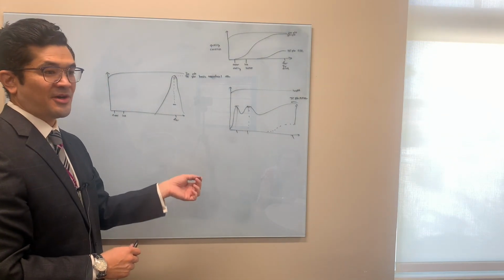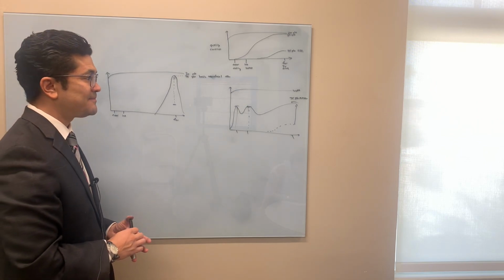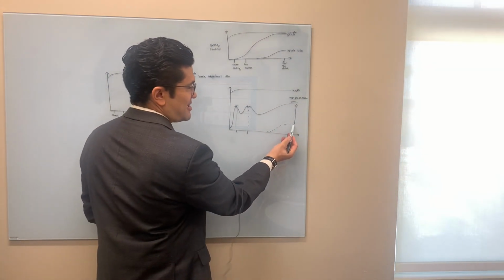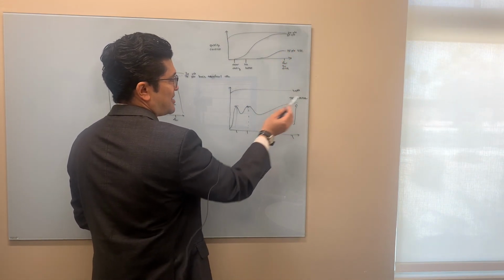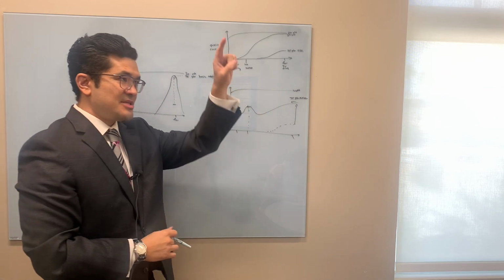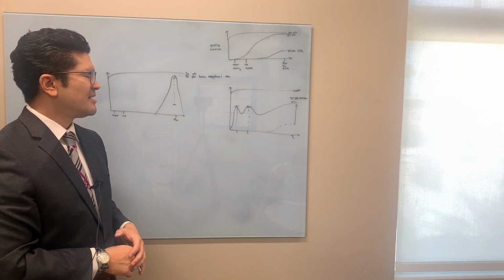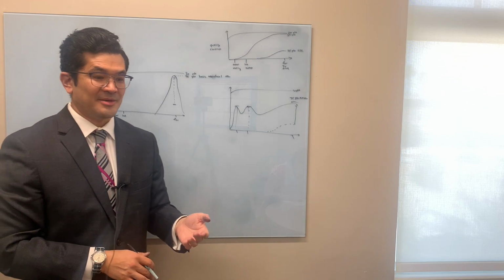Loss of contrast. And some studies say maybe 8% loss of contrast. So what does that mean? For the 75-year-old, their contrast is improved because they used to have a cataract. But our 50-year-old would notice the decline with the multifocal lens. They would see the letter E, but they would see a halo or edge artifact to it. That's why that discussion is really important on our pre-op.